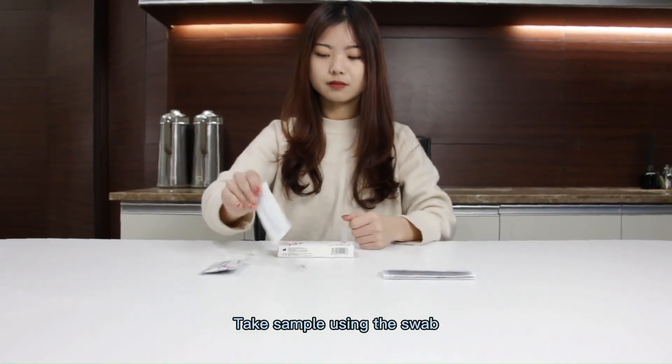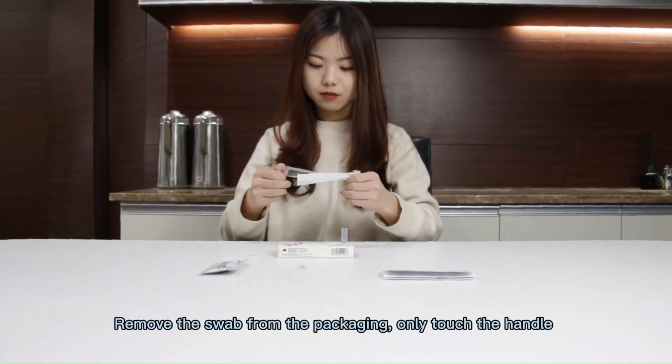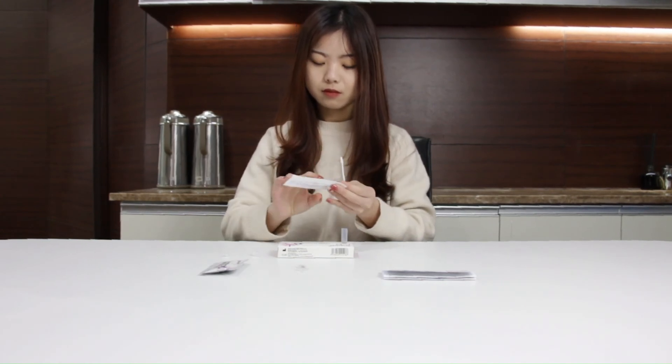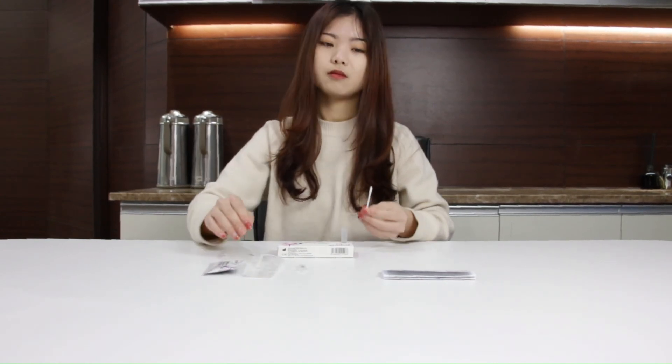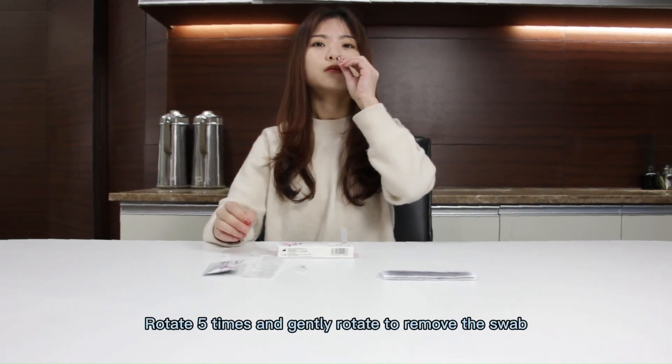Take the sample using the swab. Remove the swab from the packaging, only touching the handle. Keep your head tilted and insert the swab.